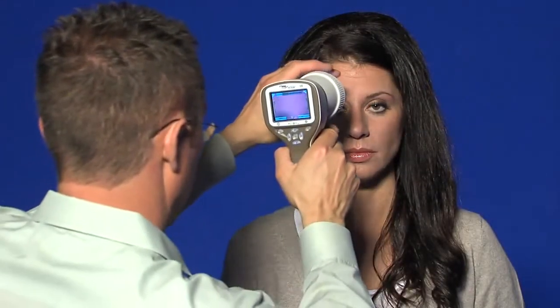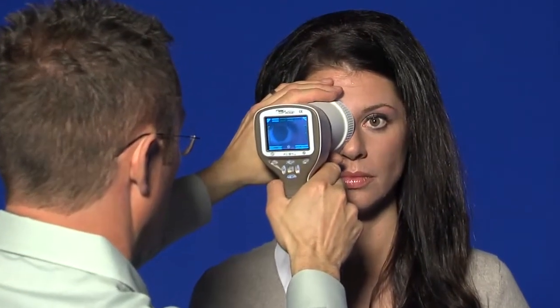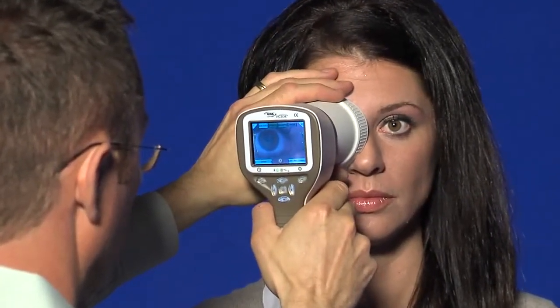Place the module cup on the patient's eye. The patient can be asked to look in different directions depending on what area of the eye needs to be captured.